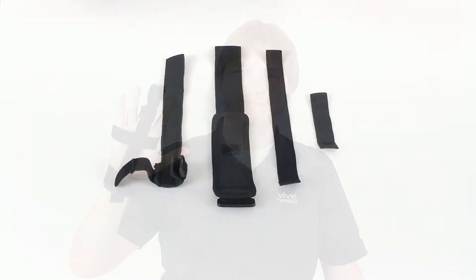Hi there, this is Devin from Vive Health. Today's video will just be a quick tutorial on how to fit the full finger trigger splint.